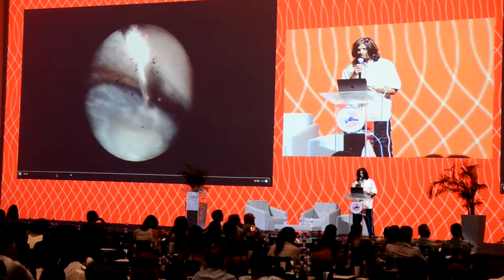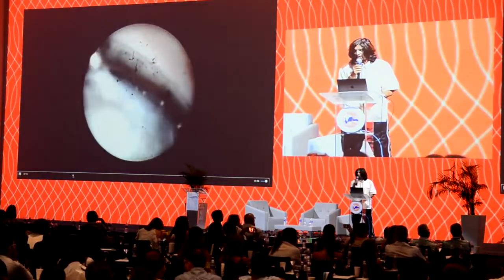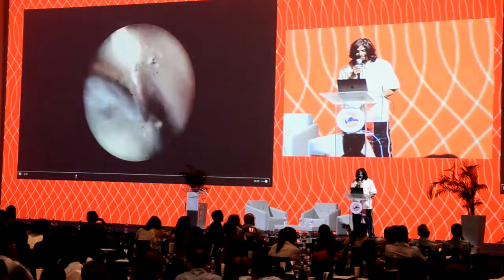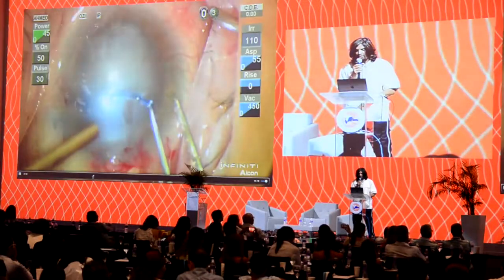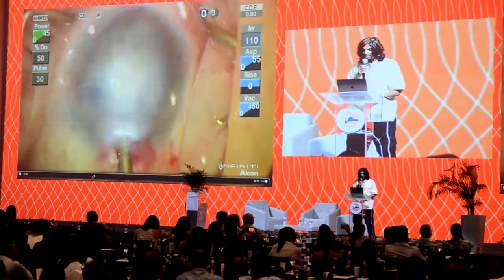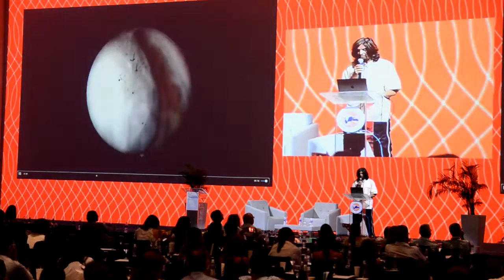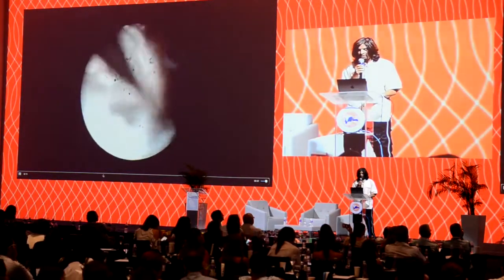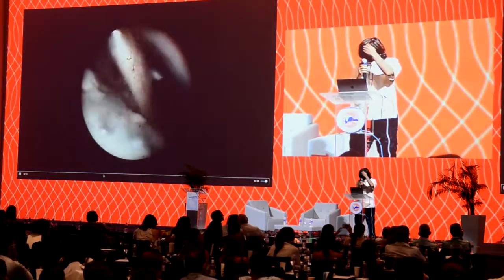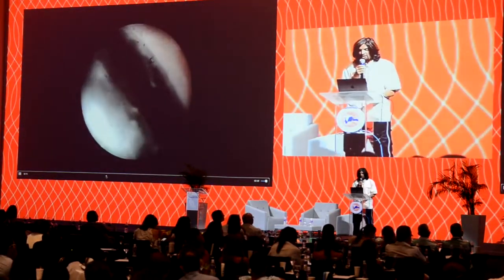And you see I'm basically doing a rhexis. I'm making sure it's a continuous rhexis. I want to make sure it's 5.5 millimeters, of course, right? And we could carry on using an endoscopic view a bit, and there we got a nice rhexis at the end of the rhexis, sorry. You can see I've got a good rhexis, curvilinear, with a dense cataract. We'll do phaco here. Hydrodissection. I wasn't sure whether I was going to be under the capsule, so we'll do it under endoscopic visualization.